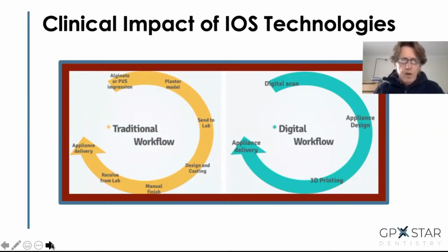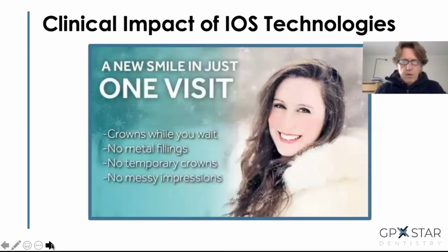So if you do go the clinical way, you can actually save time in producing the same structure that you would have done over a week. You can now do it in a day or two. It also, as I say, brings you one-visit dentistry. Depending on where you want to fit in using an intraoral scanner, you can do crowns immediately. You don't have to do anything in amalgam anymore. I hope not. I really hope no one's using amalgam anymore.